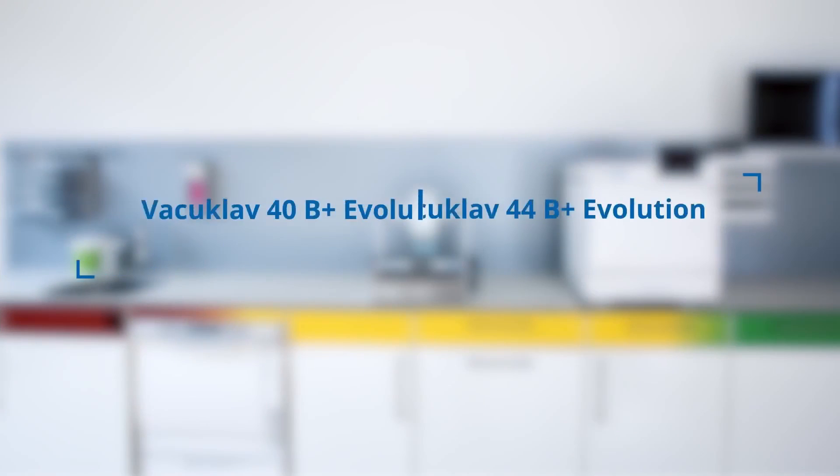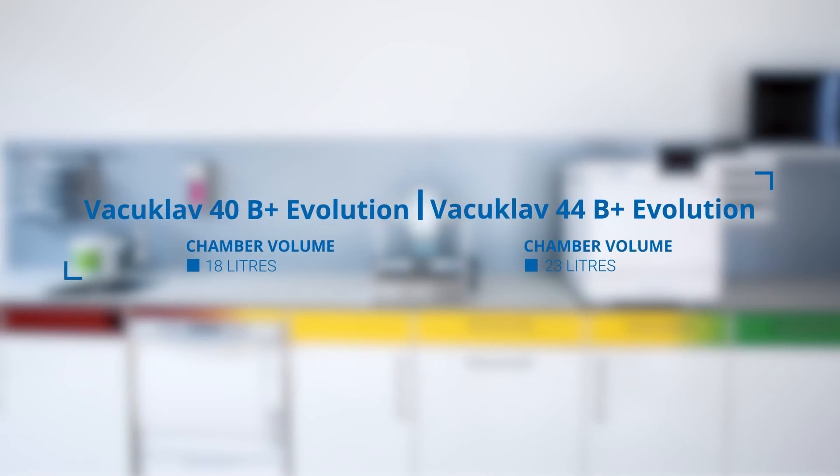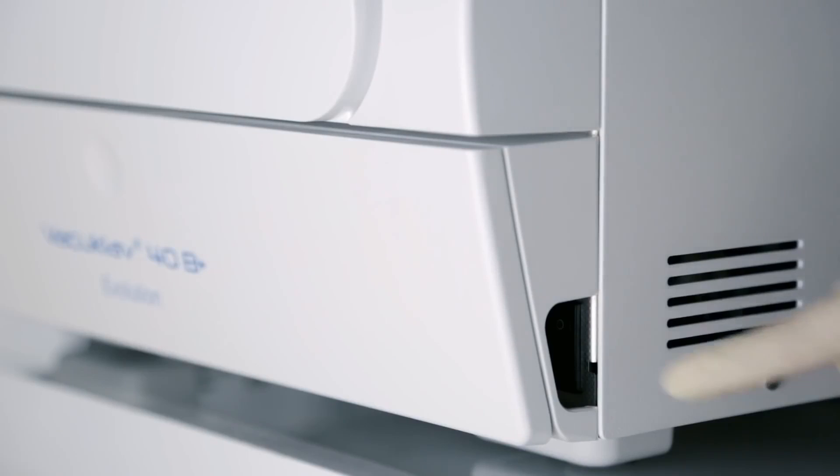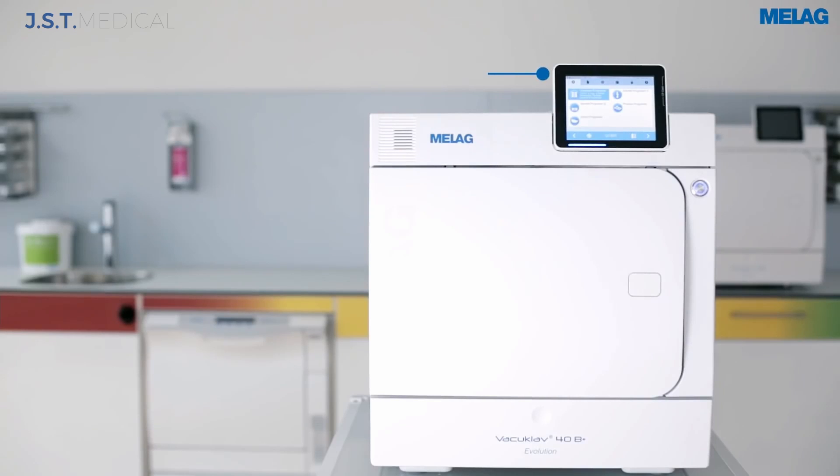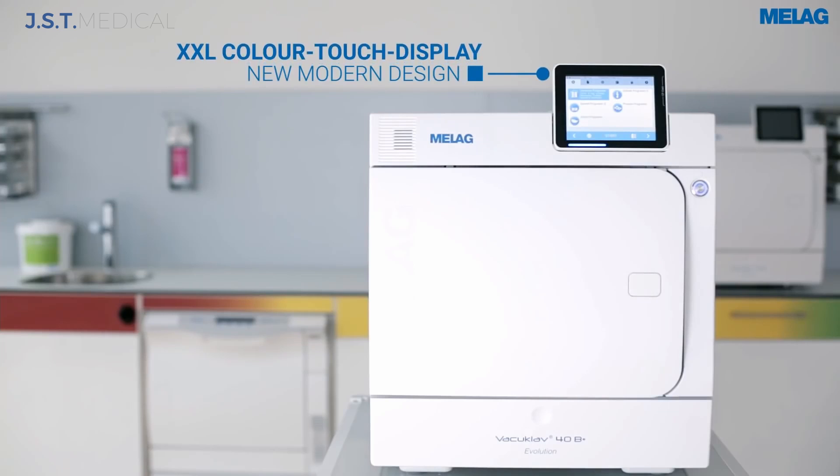Miele offer two fully plumbed units in the Evolution Benchtop range: the 40B and the 44B. The 40B is an 18-litre chamber with a tray length of 29 centimetres, while the 44B is a 23-litre chamber with a tray length of 42 centimetres.